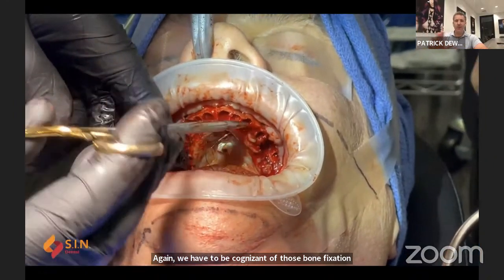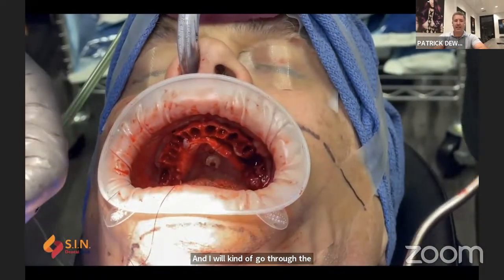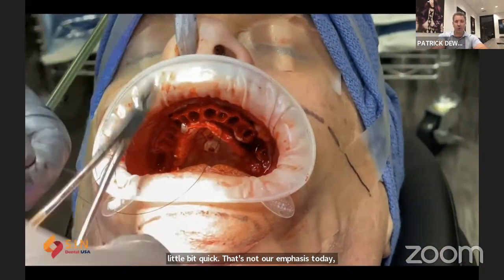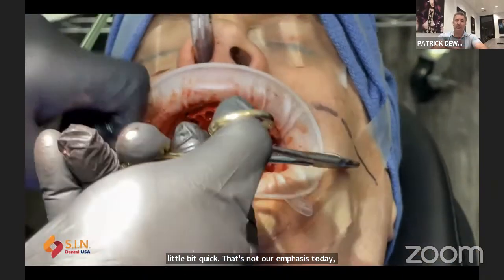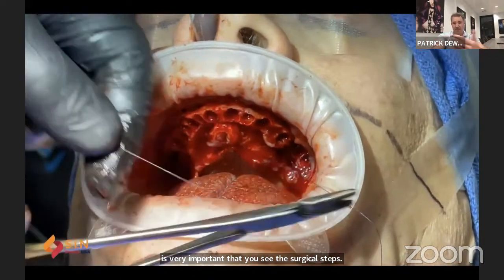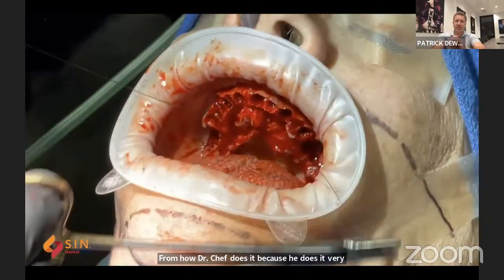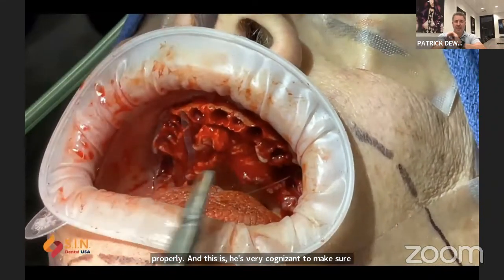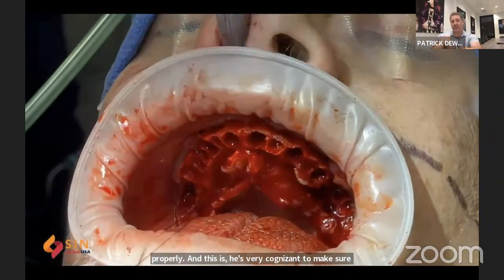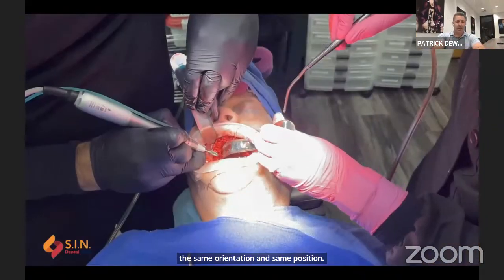And I will go through the surgery portion a little bit quick. That's not our emphasis today. Primarily, we're focused on the digital workflow, but it is very important that you see the surgical steps from how Dr. Sheth does it, because he does it very properly. He's very cognizant to make sure he doesn't mess with those landmarks that we need in the same orientation and same position preoperatively as postoperatively.